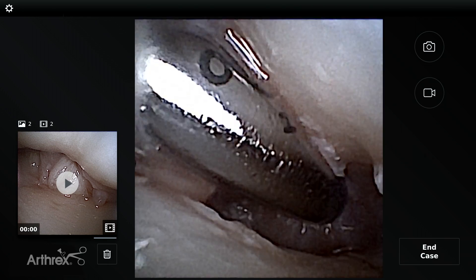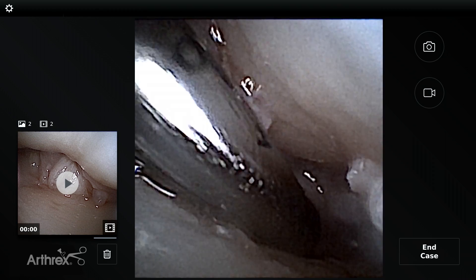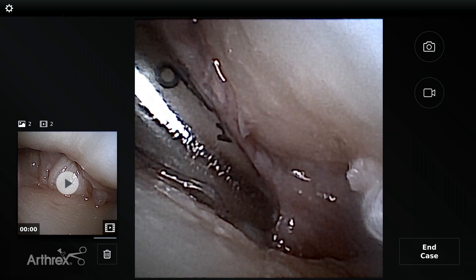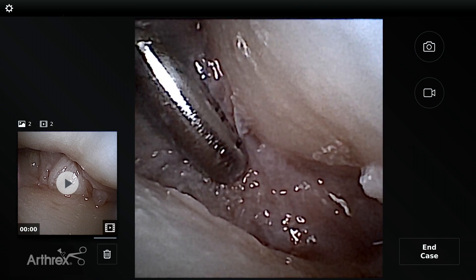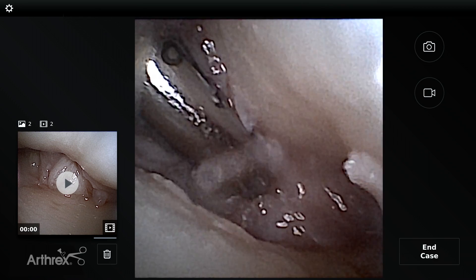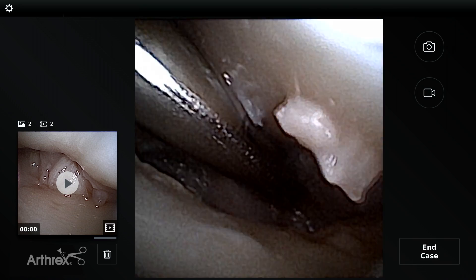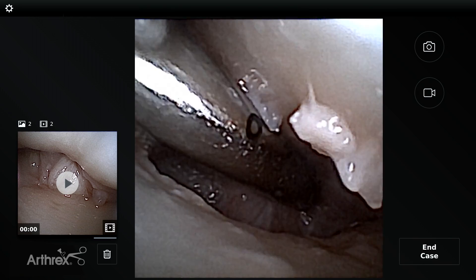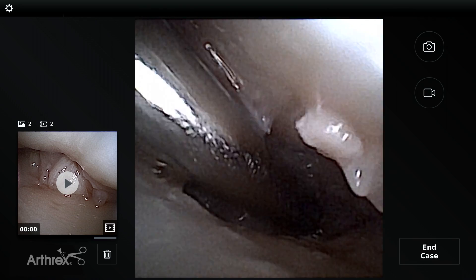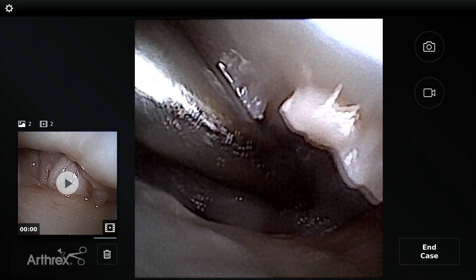With the camera in the 1U portal, we're doing an arthroscopic synovectomy through the transthenar portal. You can see how tight the joint is — this is a two-millimeter shaver, and the joint is now at about three millimeters in terms of its diastasis. It's a tight joint, but yet with the nanoscope we have an unparalleled view as we're debriding the synovitis. We're doing this all dry.